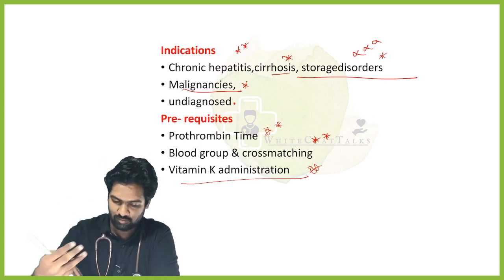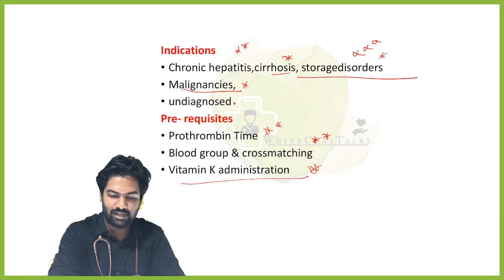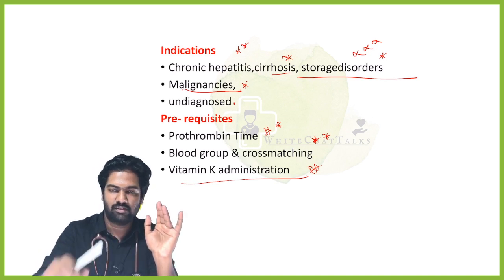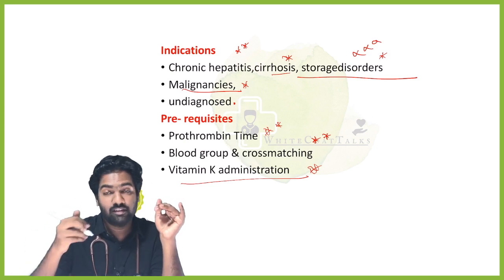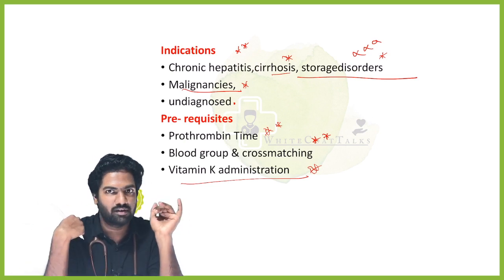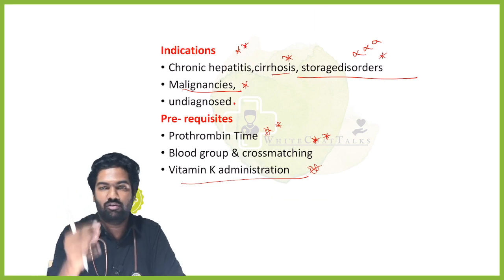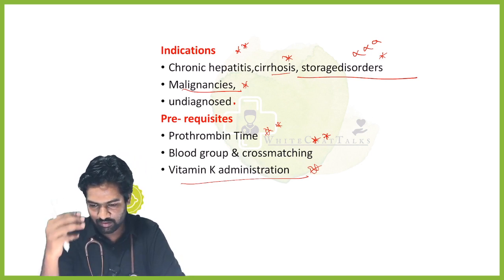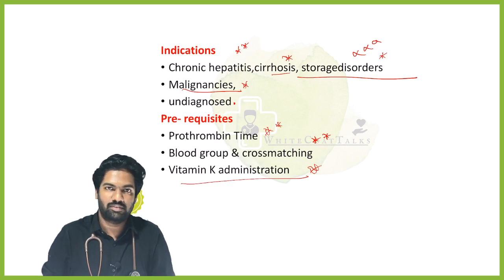The procedure part I want you to read; I can't tell the entire thing. I just want you to know the needle, identify it, say what it is, then first know what the indications are. They might go further and ask how the procedure is done, what aseptic precautions you have taken, why you have put betadine, why you used spirit later. These questions they might ask further. But the procedure part here is getting to know about instruments, parts, why they are used, and what the problems could be.